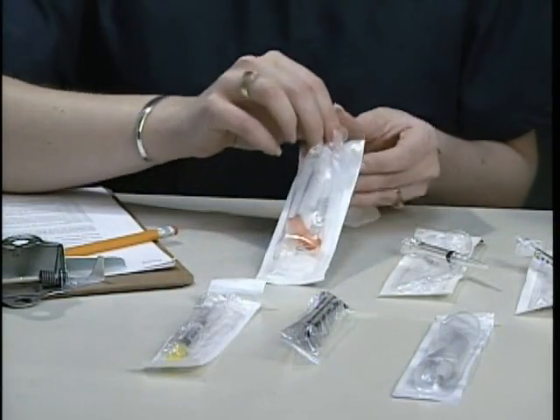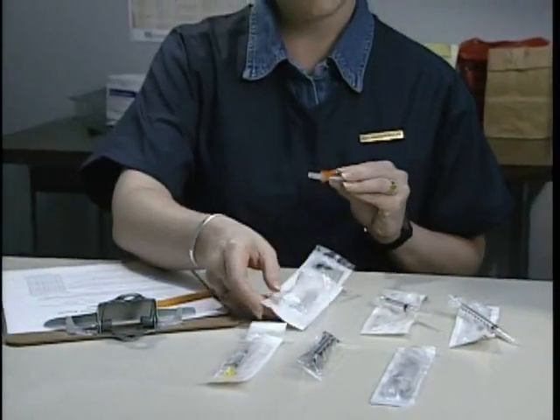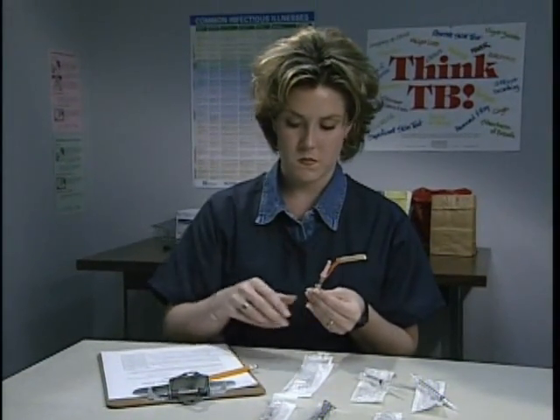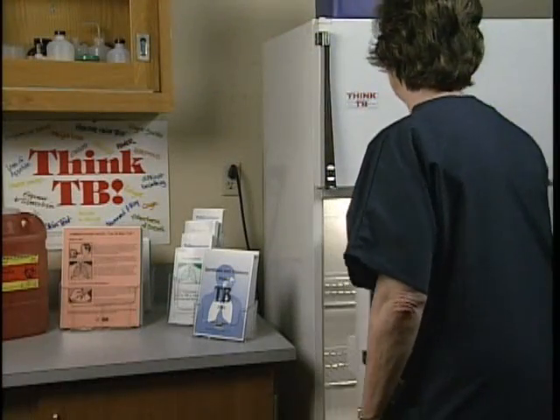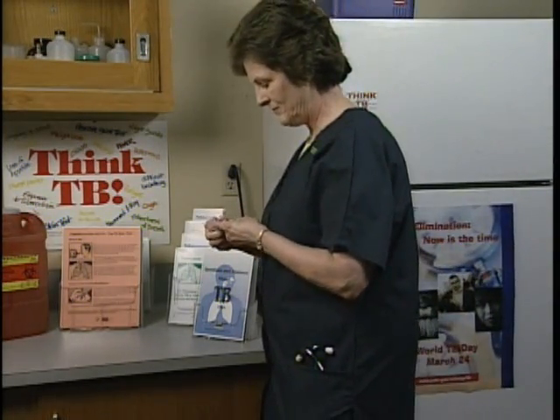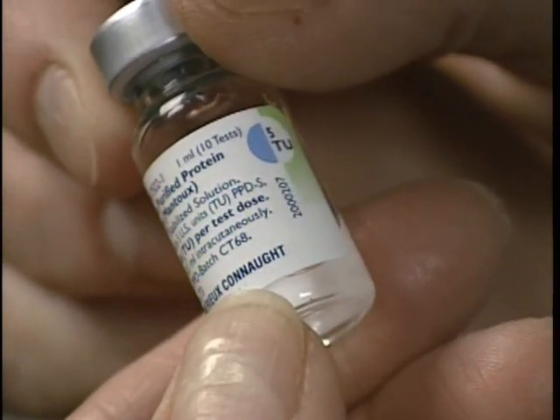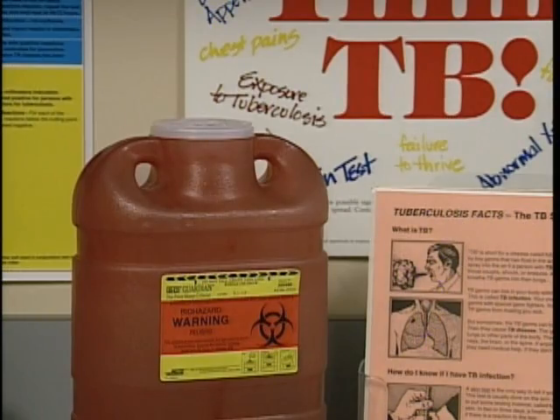Syringe and needle technologies continue to evolve to help prevent needle stick injuries. Institutional policy should determine which skin test device has been evaluated and approved for use by your facility. Look at the vial label to make sure the vial contains the tuberculin that you want to use, including the tuberculin unit strength. The label should indicate the expiration date. If it's been open more than 30 days or the expiration date has passed, the vial should be thrown away and a new vial used.